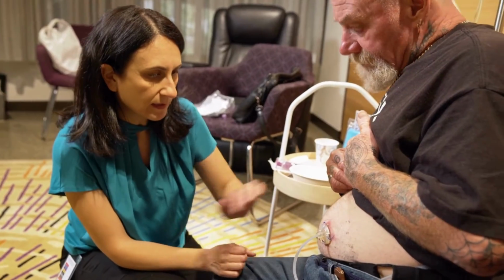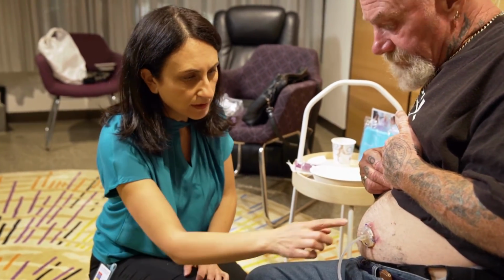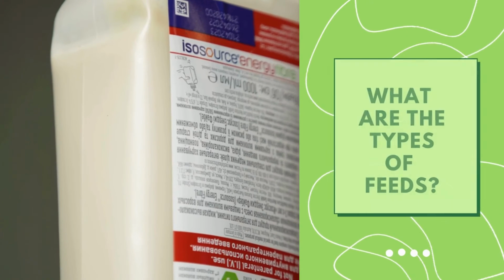We tailor our rates and the amount to fit through a 10 to 12 hour period. There's a lot of flexibility in how we tailor the feeding and the rate, so that it interferes as little as possible with you in the evening.